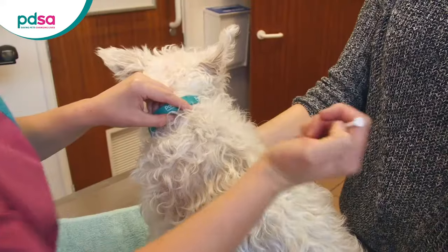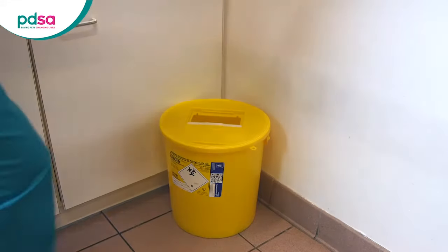It might mean that you've entered a tiny blood vessel. Take the needle and syringe out of your pet and put it into the yellow sharps container. You'll need to start again with a new syringe and needle.